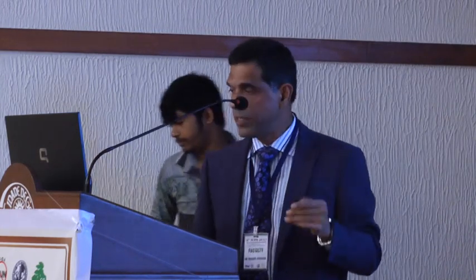That's just depicted in images here. Pressure goes in the axial direction, and sliding you can do either way along the length or along the breadth of the probe. Rotation is around one of the points along the length, and it need not be the center, it could be towards one of the ends. And tilt is on the edges of the probe. One thing that is not mentioned here is you can also put pressure along the heel or toe of the probe. That way you can look at a particular nerve which is going in a different direction.